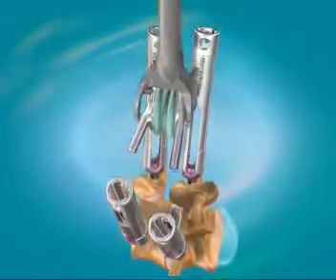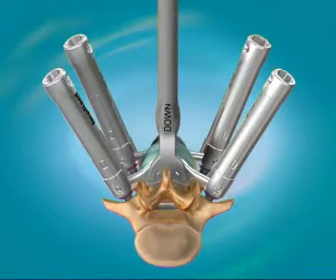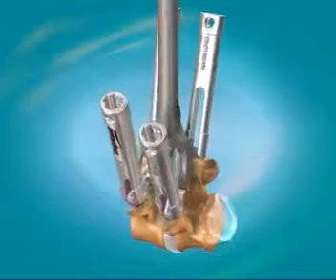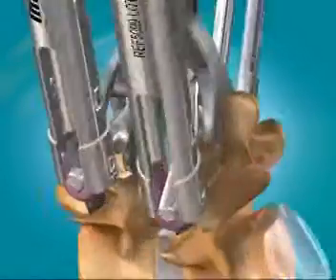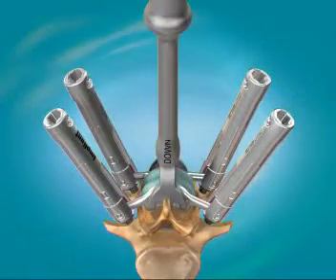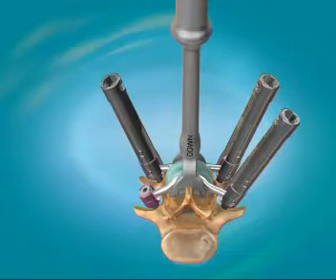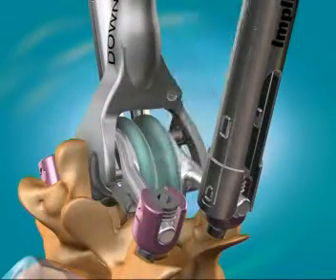Insert the TOPS into the pedicle screw heads, using the pedicle screw guides. Verify vertical positioning of the holder. After all 4 arms are placed in the saddles of the pedicle screws, insert 4 set screws through the pedicle screw guide and hand tighten them, using the screwdriver to secure the TOPS arms to the pedicle screws. Remove the 4 screw guides by inserting the screw finder before proceeding to the next step.